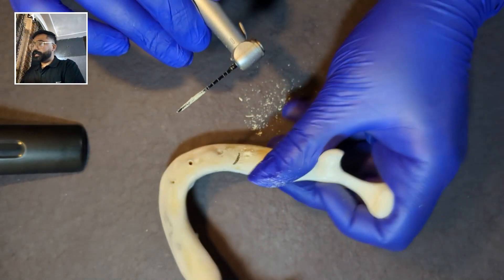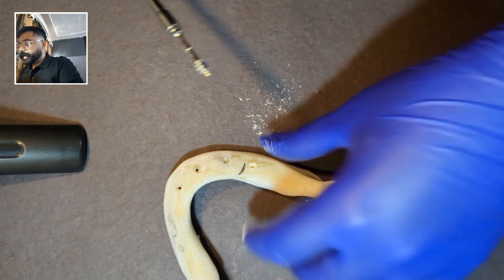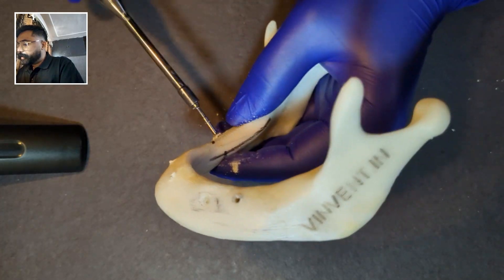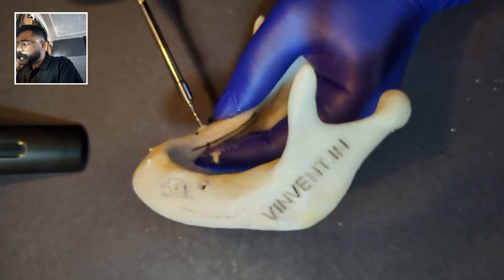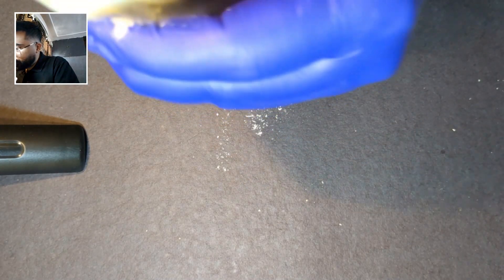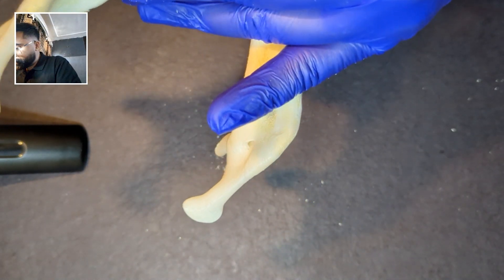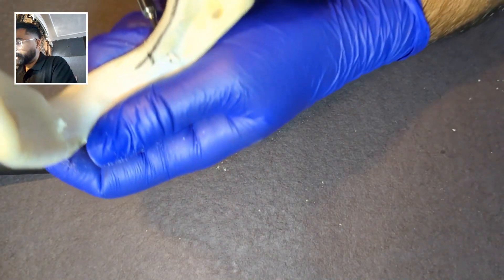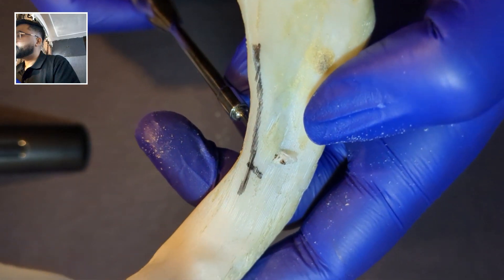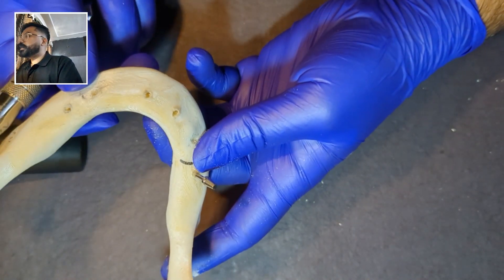I have just perforated and I don't have to go beyond that. Once I feel the tip of the drill, I will take my implant and start tightening it in the osteotomy site. I will stop when I feel the tip of the implant emerging from just below the mylohyoid. Everyone can see the implant is now coming out of this area — the tip has just emerged just below the mylohyoid. Now I have engaged the lingual cortex.